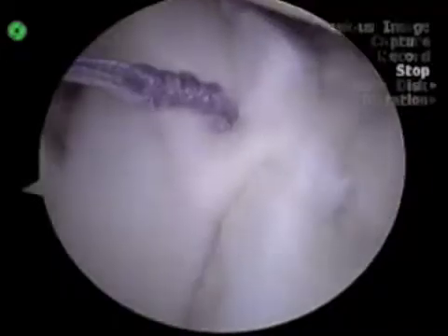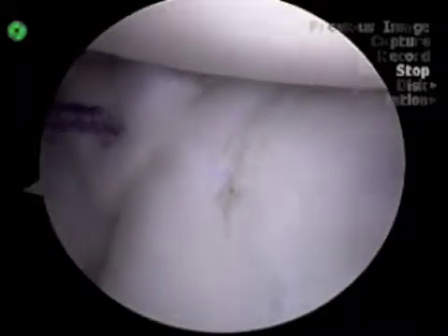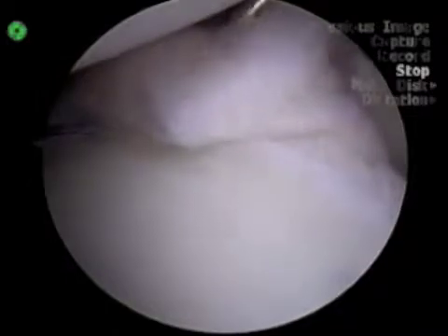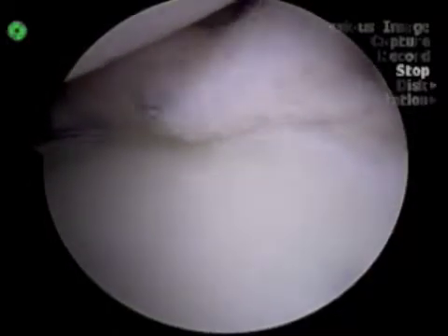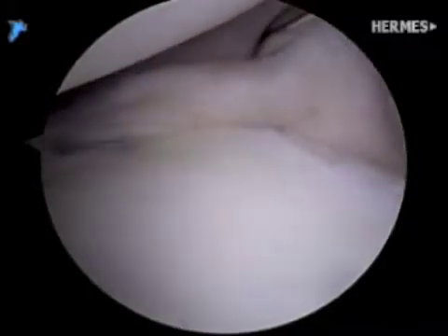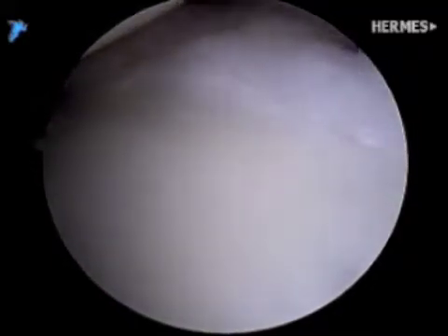Here we demonstrate the reinforced inferior labrum buttress, which is stable to manual stress. Anterior instability, which was the next most prominent finding on the examination under anesthesia, is addressed with the same technique at the 5 o'clock position. If there is difficulty passing the stitch through tissue, a probe from the opposite portal providing countertraction may be helpful. A dilating knot tied in front of the knot advancing the suture can also help with suture passage.